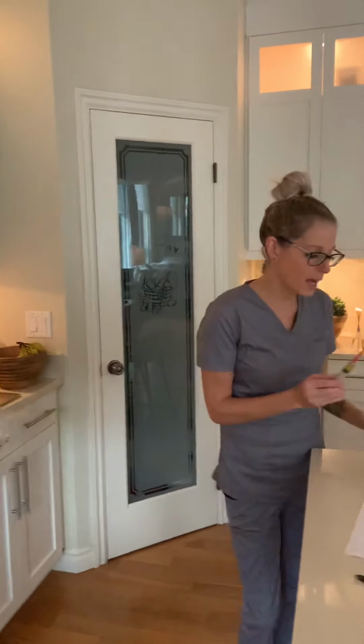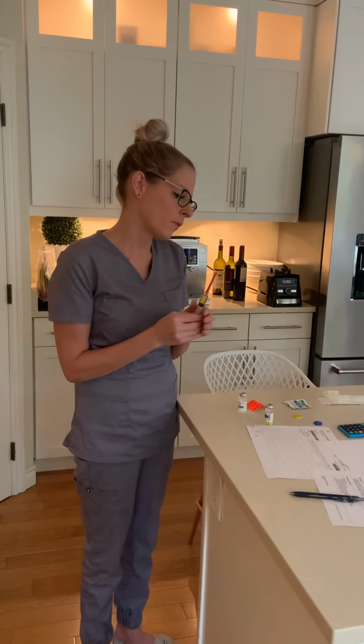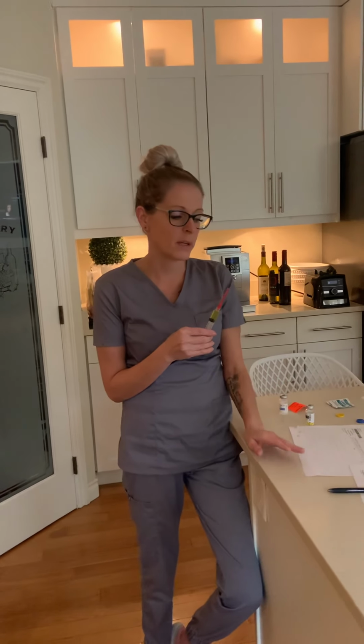From this point, I would go and take this to my patient's bedside, check the 2 identifiers, and the other thing I would be considering too, because I was paying attention to the adverse effects of it, just the diarrhea, vomiting. I would check the site before I went to administer again, and I would also do a follow-up after.